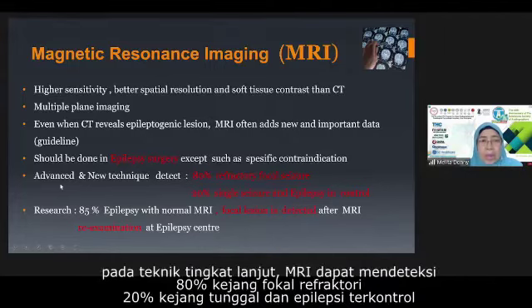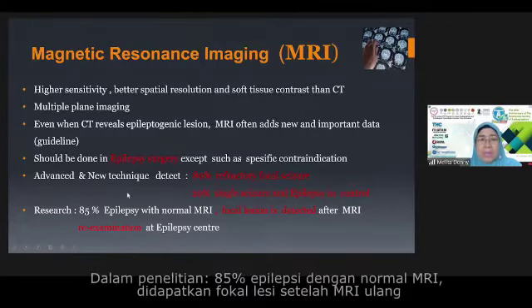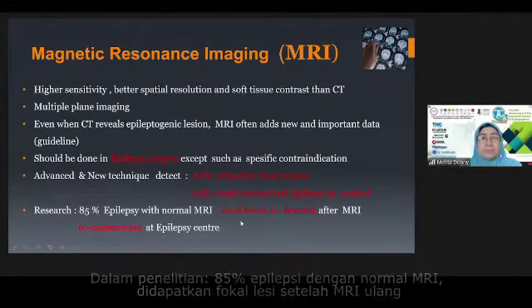And with new advanced technique, we can look at 80% of the refractory focal seizure and 20% of single seizure in epilepsy in control. And in research, in 85% of epilepsy with normal MRI, we can find focal lesion after re-examination with MR.